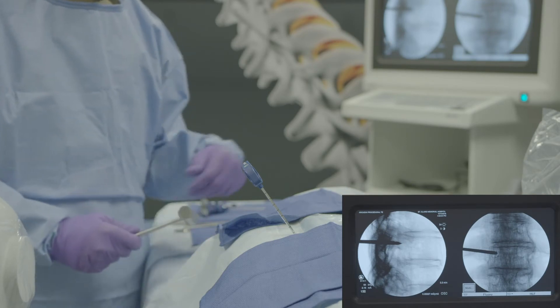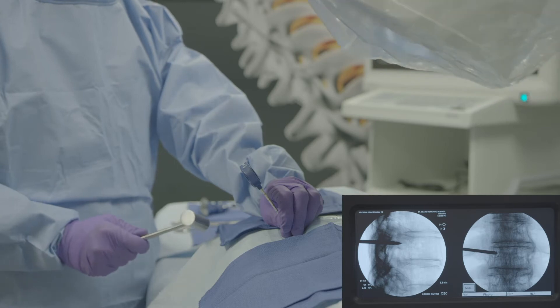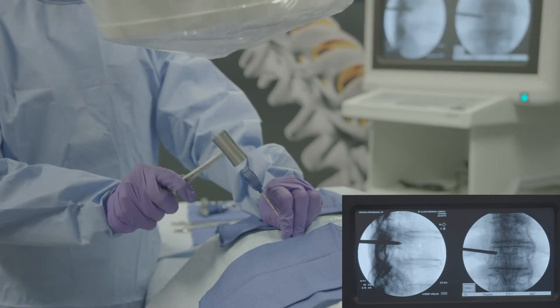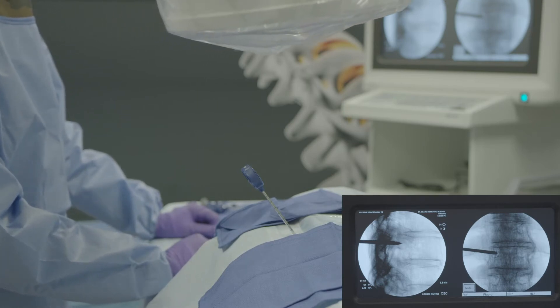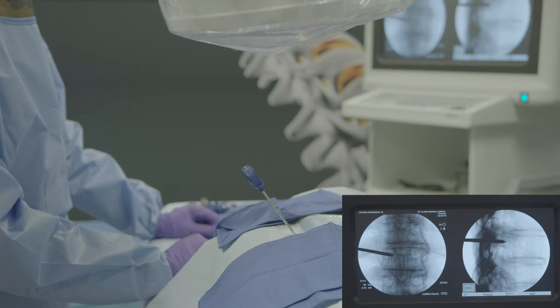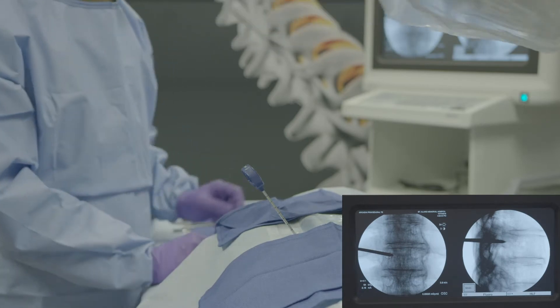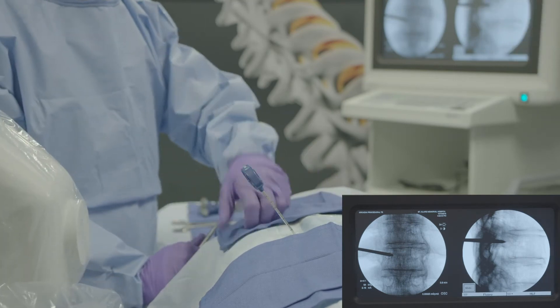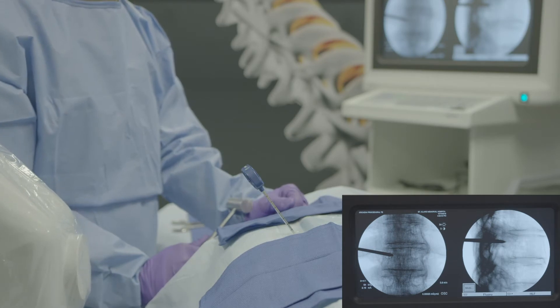In the AP view, advance the access introducer to the medial border of the pedicle. Do not advance the access introducer beyond the medial border of the pedicle without verifying in the lateral view that the access introducer tip is at or beyond the posterior wall.